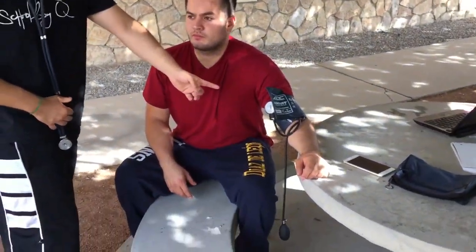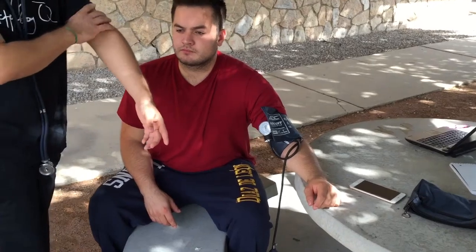It is also important for the subject not to consume any nicotine, caffeine, or any other substances that might alter his heart rate. When you take the blood pressure reading, you want to have their bare arm — as you can see right here, the blood pressure cuff is already wrapped around his bare arm.